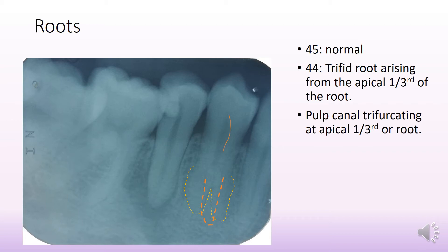You will also see the outline of the pulp chamber entering the canal, also being trifid. You can see the trifurcation very clearly in the apical one-third of the root especially.